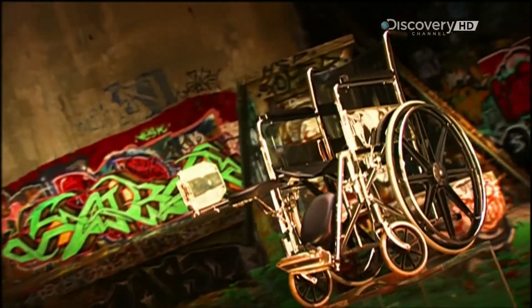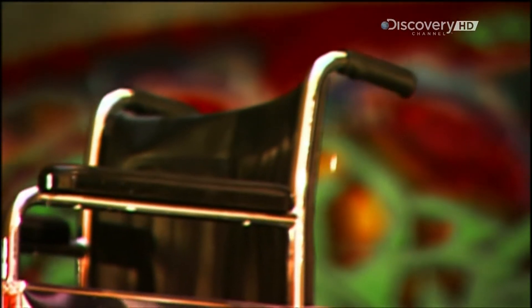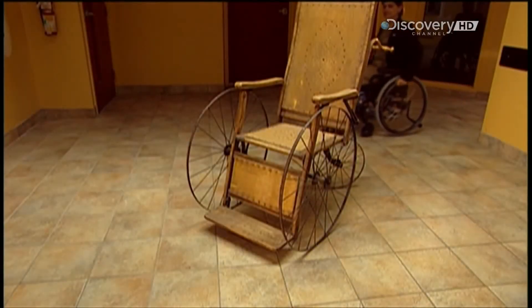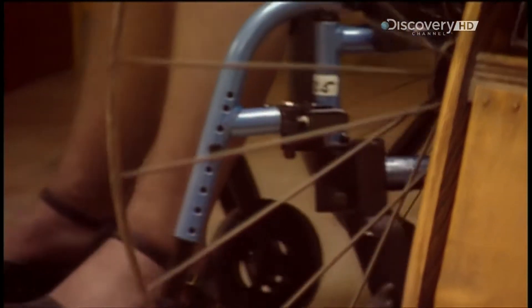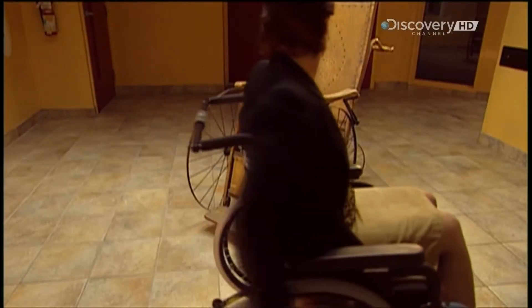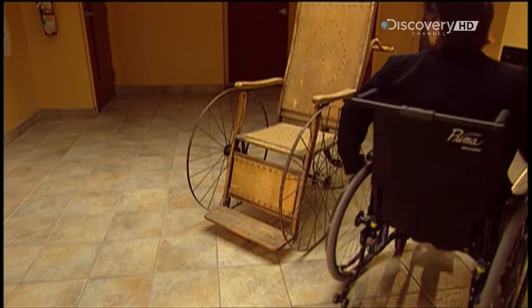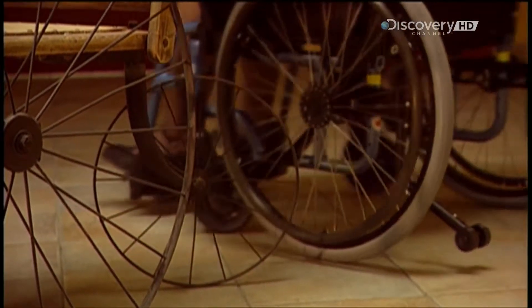Today's wheelchairs are widely available with a variety of features and prices. This wood, leather and steel chair is a World War II antique. A modern wheelchair literally runs circles around it. With hundreds of possible design options, today's wheelchair fits the user and the user's lifestyle.